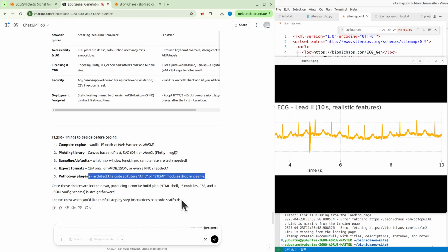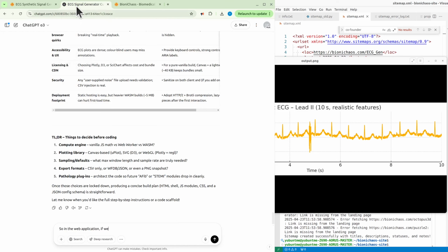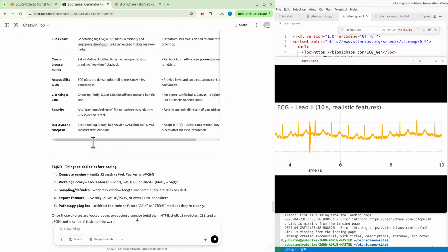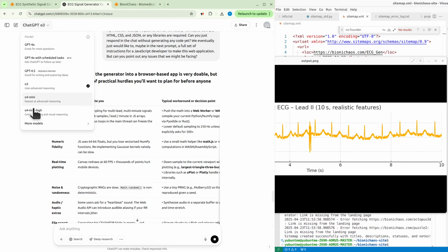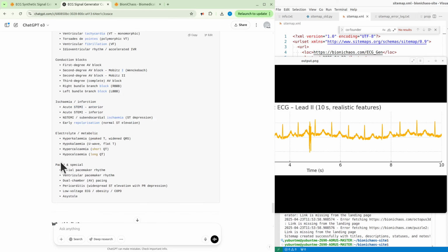So in the web application, if we are having a drop-down of ECG signal type, and the default is normal, if we are having a drop-down of the different types of ECG, normal and abnormal, what should the list include? Do we still need all three? I'm pretty sure all would have been able to answer this. Yeah, so we would have a normal. Let the bot actually read this.